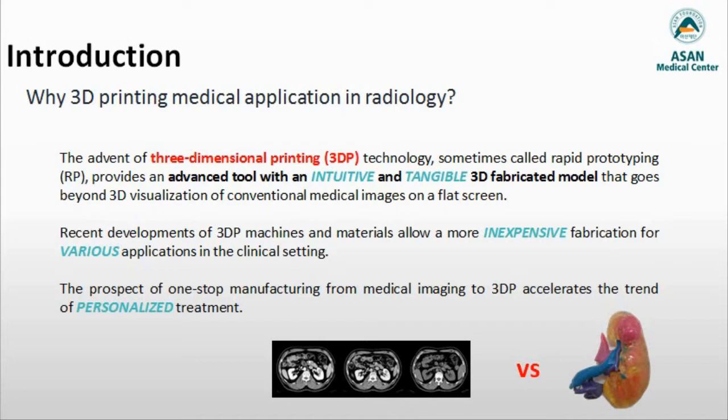With the help of advanced medical imaging modalities such as CT and MRI, image post-processing technologies can be combined with a variety of tools such as multiplanar reformation, 3D visualization, and image navigation, which are pivotal in both diagnosis and treatment. The advent of three-dimensional printing technology, sometimes called rapid prototyping, has provided a more advanced tool with an intuitive and tangible 3D fabricated model that goes beyond a simple 3D shaded visualization on a flat screen.